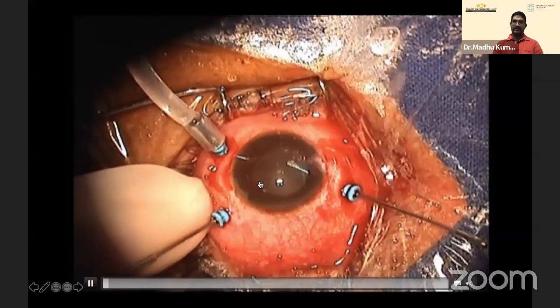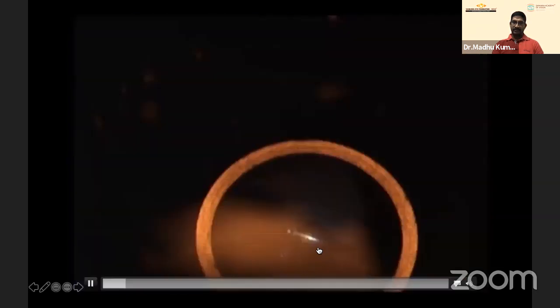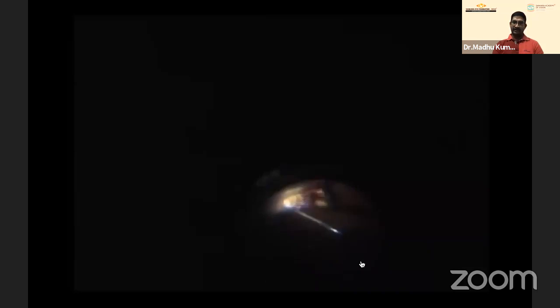A 25-gauge three-port vitrectomy was performed. The principle remains: debulk the vitreous. PFCL is placed over the disc and macula to protect against inadvertent foreign body drop that could damage the optic nerve and macula. This was a tricky step — within just one week, the foreign body had already formed a thick capsule, requiring careful dissection without causing retinal tear or traction.